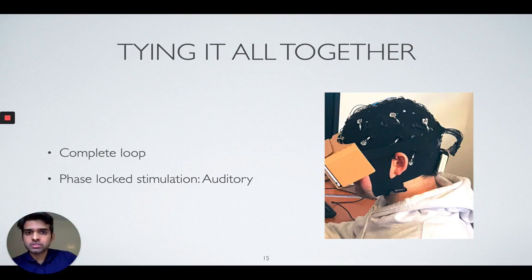That brings us to what's next and the future plans. Essentially, we have to tie all these different bits together: the stimulation, the feedback, the signal processing, and the sensing, to complete the loop and test and characterize that platform. And again, like I said, we're targeting the sleep engineering application.